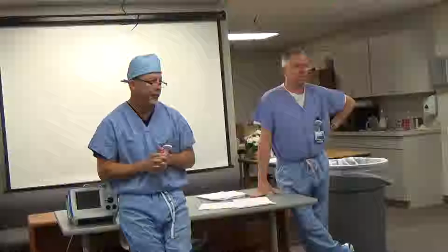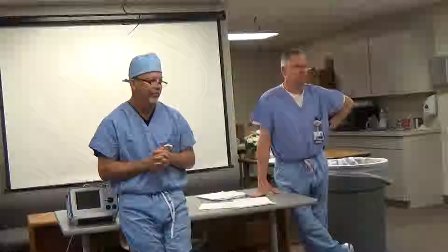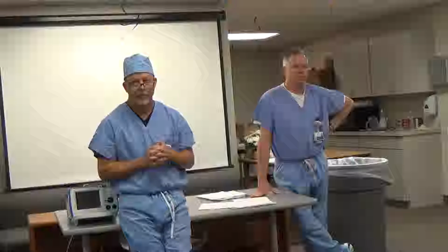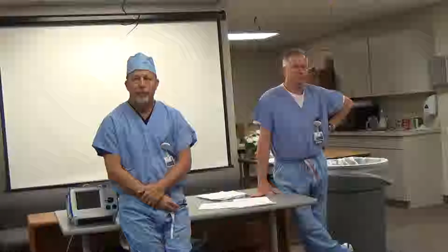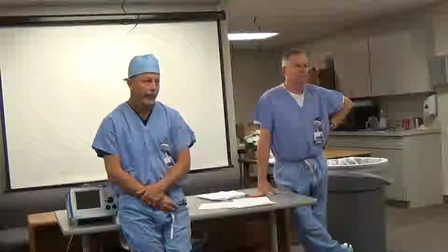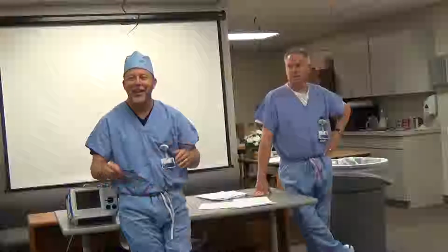The thing is, people that are going to get the crash cart don't know if it's an adult or a child. Well, there's a new standard that we are going to have 2 crash carts, one in front of the red line, a pediatric and an adult, and one behind the red line, a pediatric and an adult. That's a new North Carolina statute. Where are we going to put that? Besides the anesthesia machine, I'm kidding.